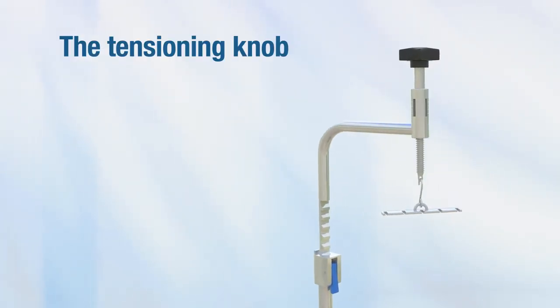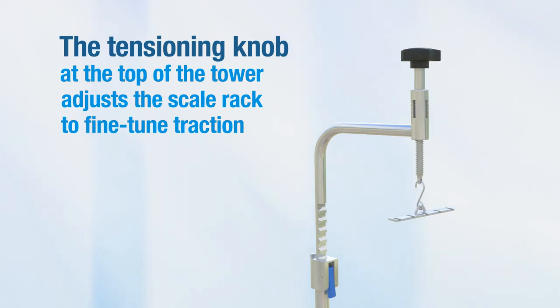In addition, the tensioning knob at the top of the tower adjusts the scale rack to fine-tune traction.